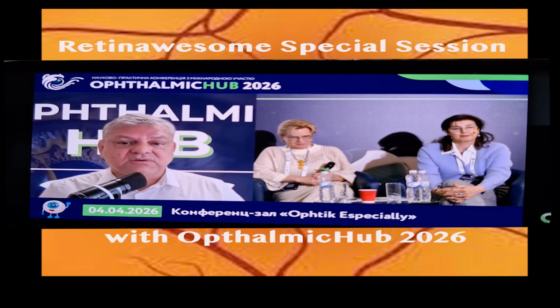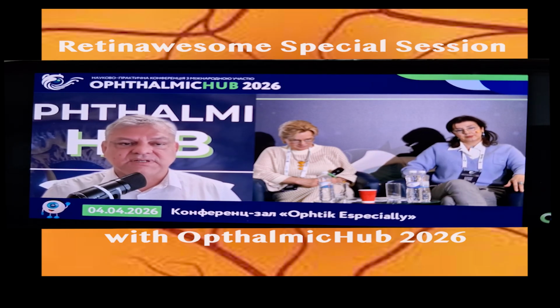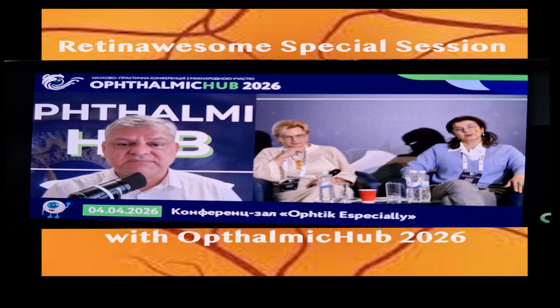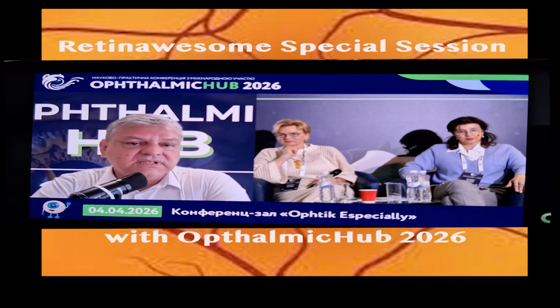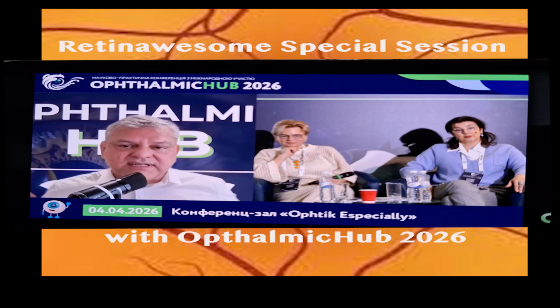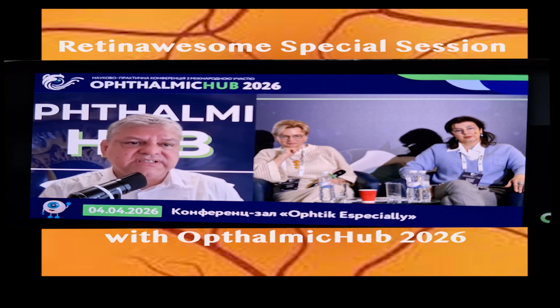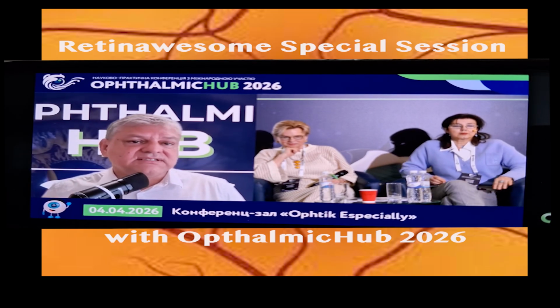Answering your question about what tamponade to use, I usually like using intraocular gas, of course, but in some cases we can use silicone oil. With intraocular gas, you go with the gas diluted, probably 30%, through the infusion line. By injecting the gas through the infusion line, you keep the pressure control. You do that very slowly, and you have a good feel and a good arc of contact with the gas.